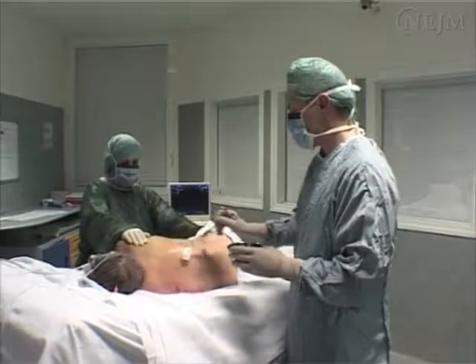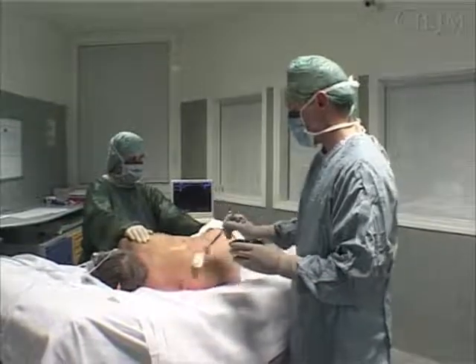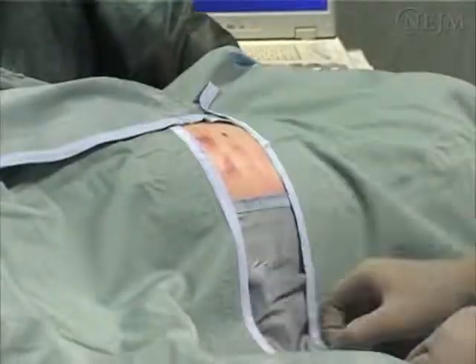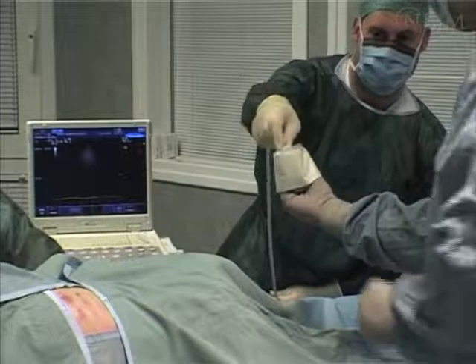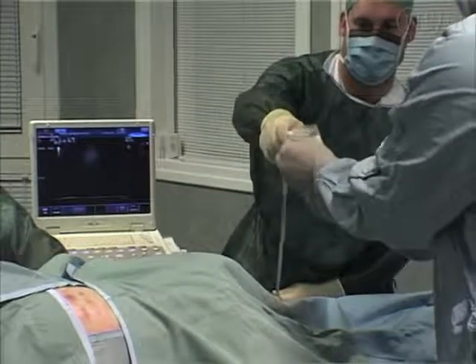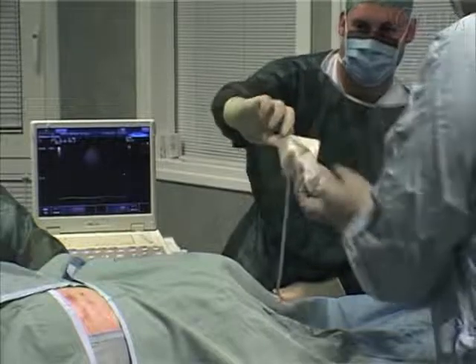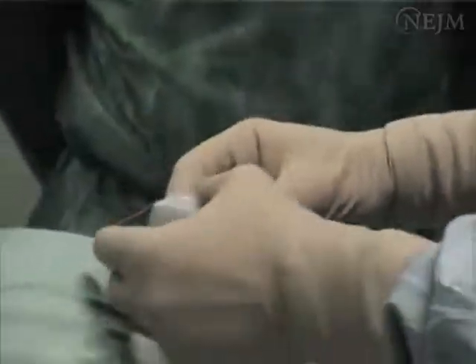Using gauze soaked in a sterile disinfectant preparation, thoroughly disinfect the skin and place the sterile drapes around the selected site. Prepare the probe: with the help of a second operator, apply ultrasound gel to the probe and cover it with a sterile sleeve, then secure the sleeve to the probe.